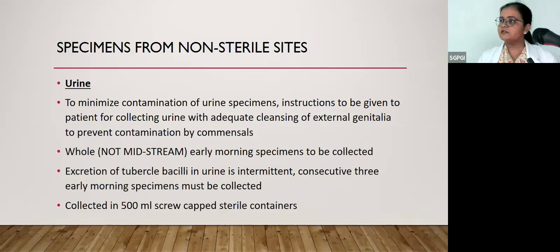Specimen from the non-sterile sites. Urine specimen. To minimize contamination of the urine specimen, instructions are to be given to the patient for collecting the urine with adequate cleaning of the external genitalia to prevent contamination by the commensal. Whole early morning sample.